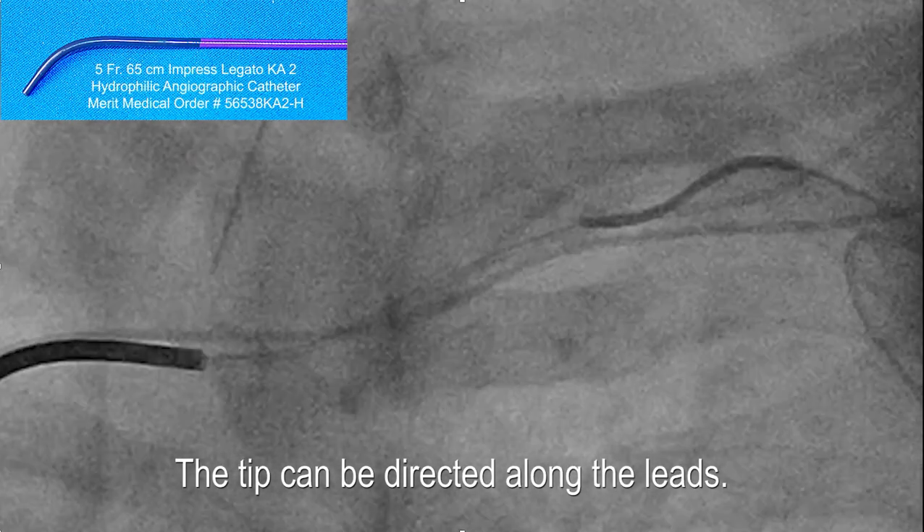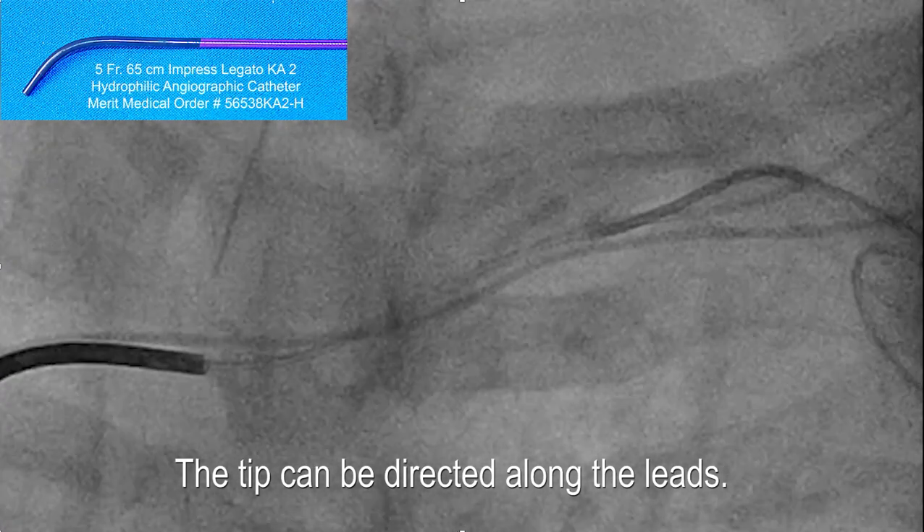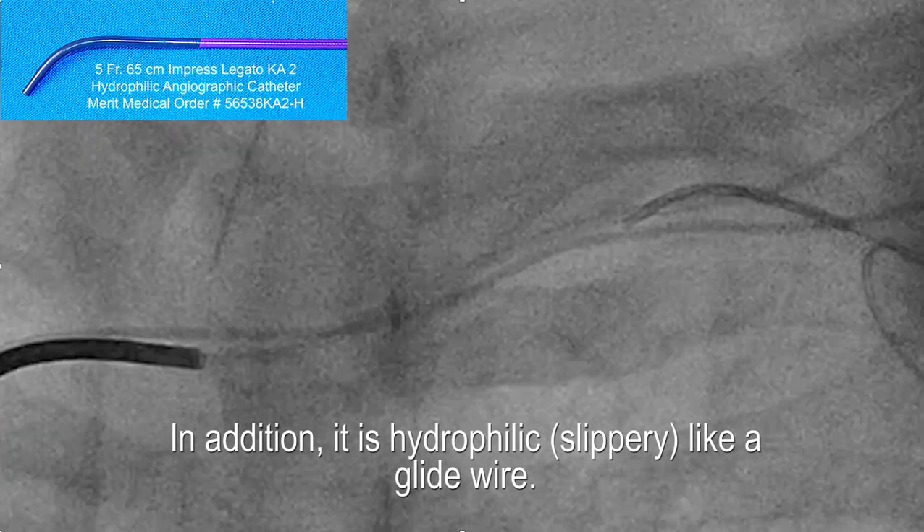With that short tip, when you torque the back end of the catheter, the tip moves even though part of it is constrained by the fibrous tissue, because the whole tip isn't constrained by the fibrous tissue.